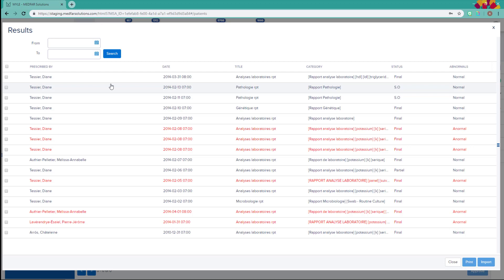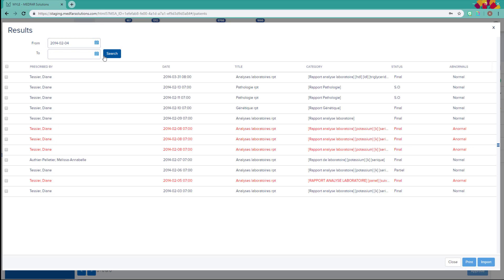Use these two boxes to filter the results by their date. Click on Search to refresh the list. Click on a results line to view it.